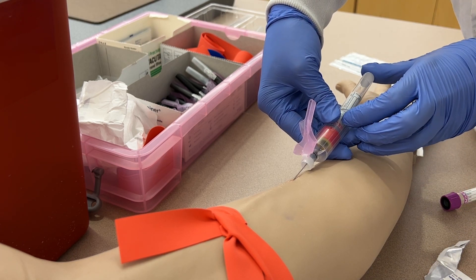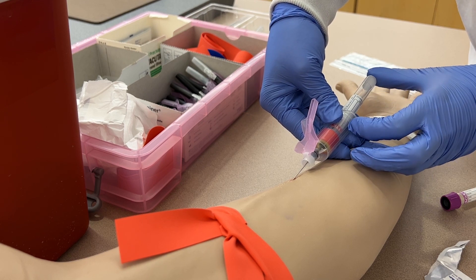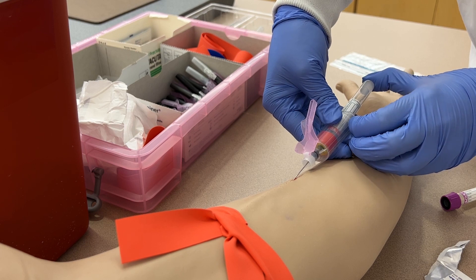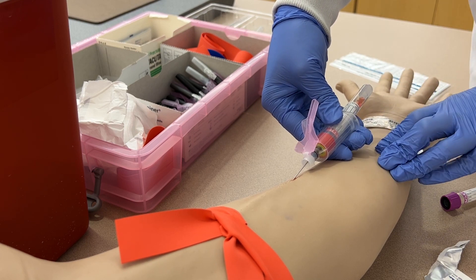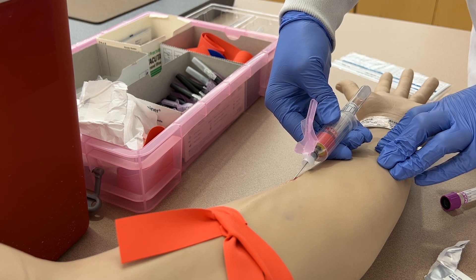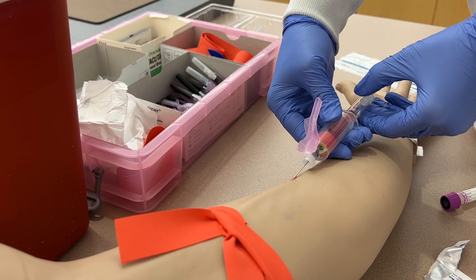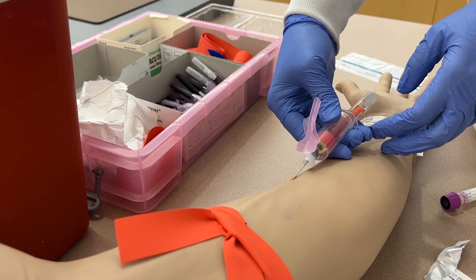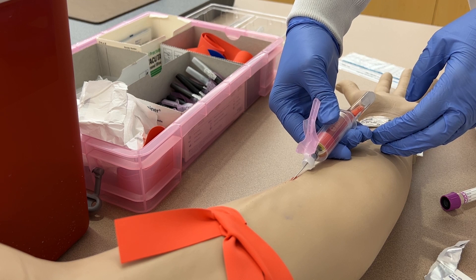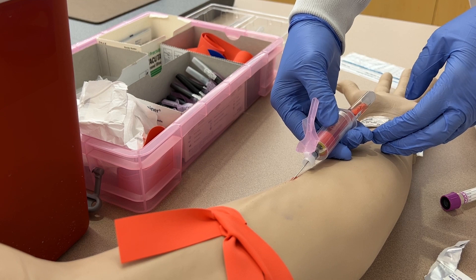To push the tube onto the needle, place your thumb on the bottom of the tube and your index finger on the top ledge of the tube holder, then pinch your fingers together. You can then see if the tube is filling with blood and spin the label around to see the blood drain into the tube. If you aren't in the vein, you can slowly advance and retreat the needle by moving your thumb backwards and forwards.